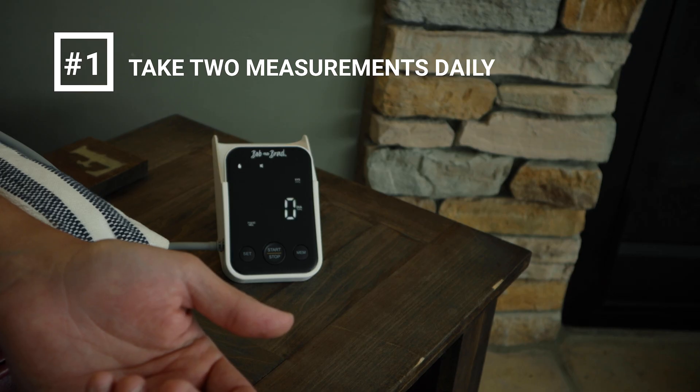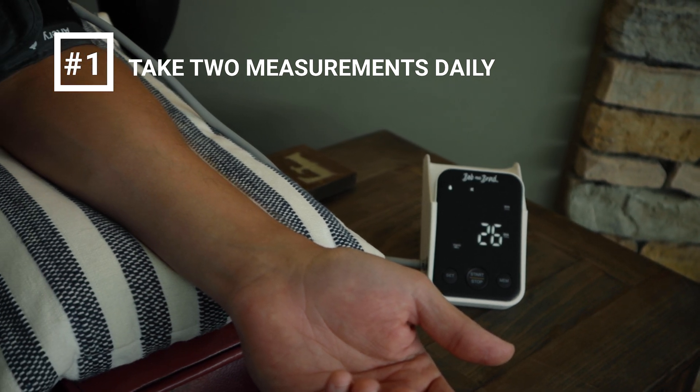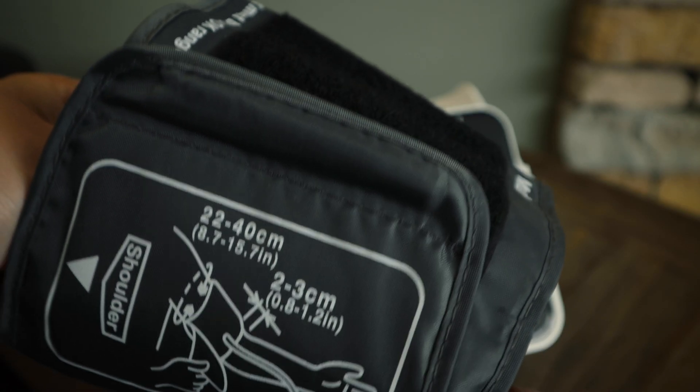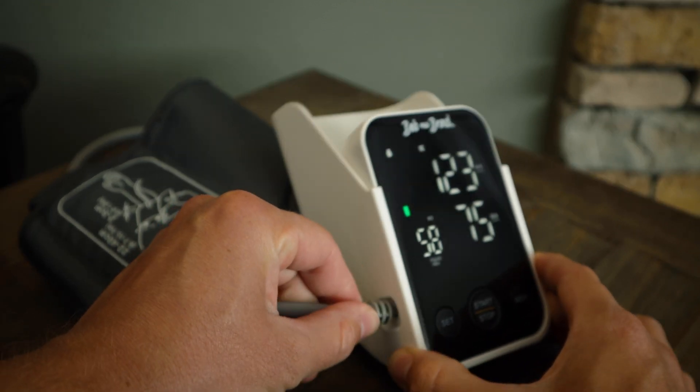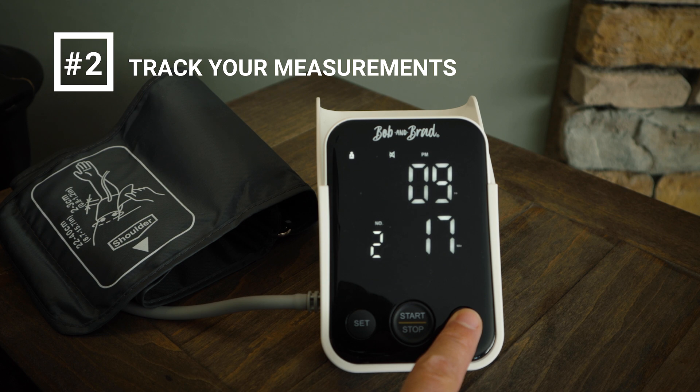Here are a few tips for taking your blood pressure. Number one: it's a good idea to take two measurements — one in the morning and one at night — at the same time and the same place. If you get a reading that's really off, check to make sure your cuff is attached to your arm correctly, then wait a couple of minutes and recheck. Number two: keep a log of all your readings and bring it along with the blood pressure monitor to your next doctor's appointment.